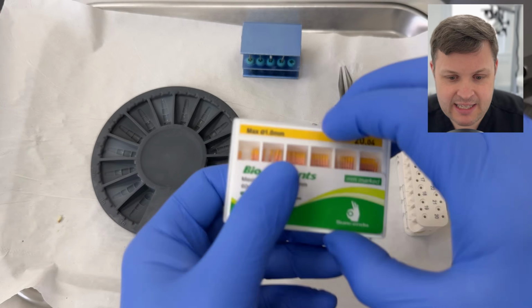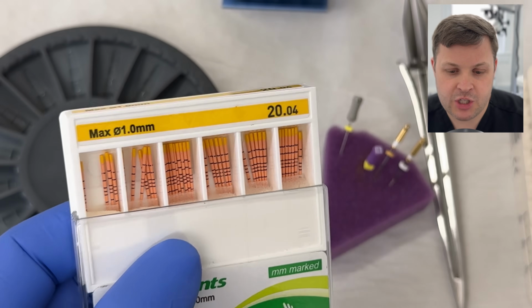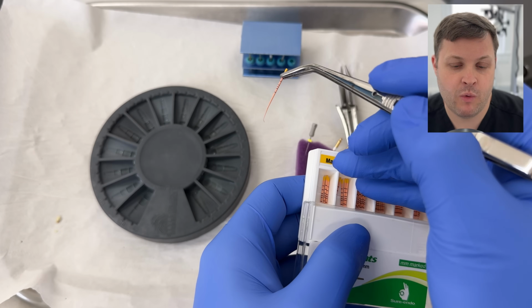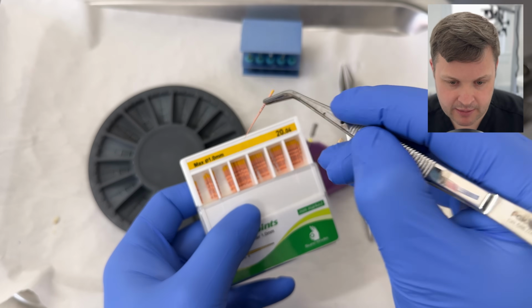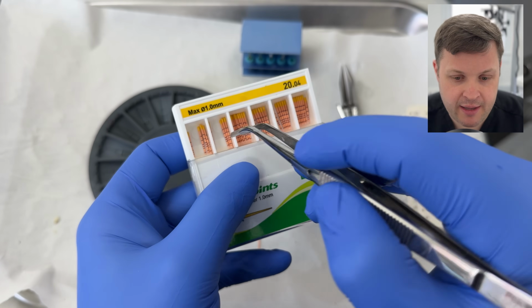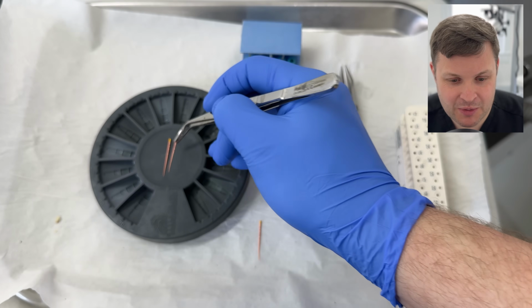And in this case, what I like to use is these maximum diameter GP cones. So these are 20 04 at the end, but they have a maximum diameter of 1 millimeter. So these are never going to go wider than 1 millimeter. Problem with these is they're very, very friable at the end. So when you pull them out, you want to have a little look at the end to see if they're bent. So the first one there was a bit bent, so I'm not going to use that. I'll put that to one side.